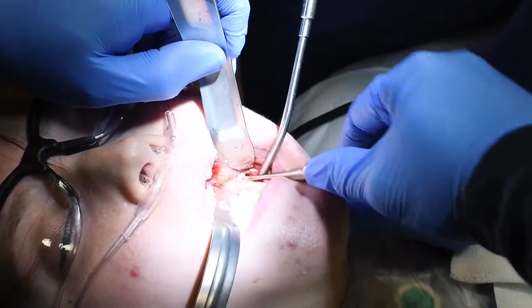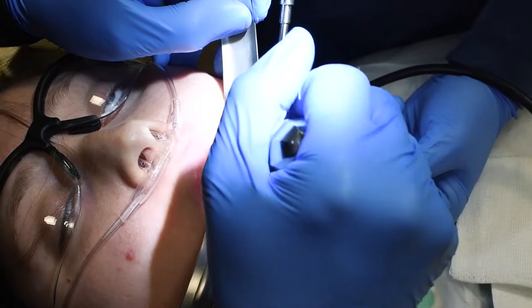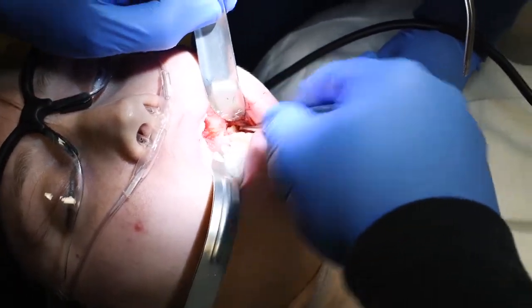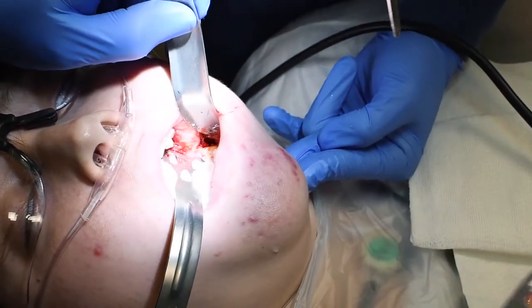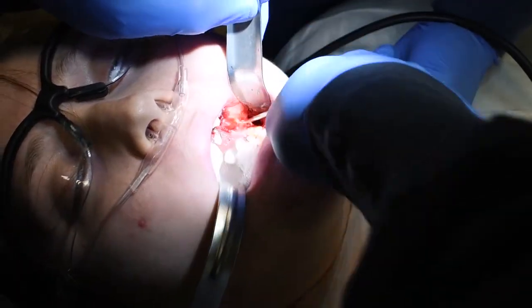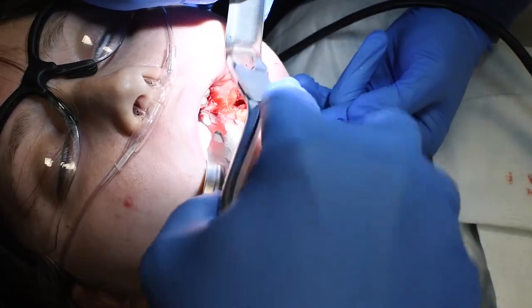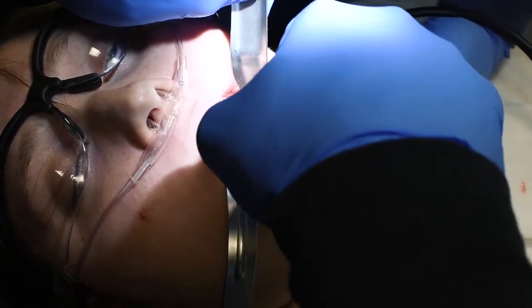We'll need a larger elevator to pick that up once we wiggle it out. I'll pick it up with the larger one. Then I need to get the front part of the tooth out so I can get in here and start elevating. With that out, we grab onto it and get it out. We've got more follicular tissue — that's part of the sack that develops the tooth, so I'm going to curette that. There's still a little bit of soft tissue follicle in there — we'll get the rongeur in to get that out. There it is — look at that cute little fella right there.